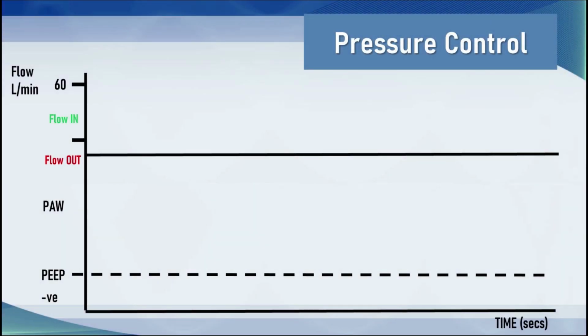Normally, when we breathe in, we breathe out almost immediately afterwards, and then there's a bit of a gap between the end of exhalation and the next breath. But normally it's a continuous cycle: inspiration, expiration, inspiration, expiration. There usually is not a pause at end inspiration. That only happens during mechanical ventilation.